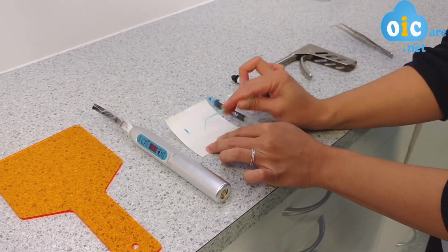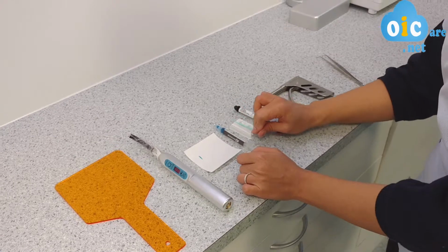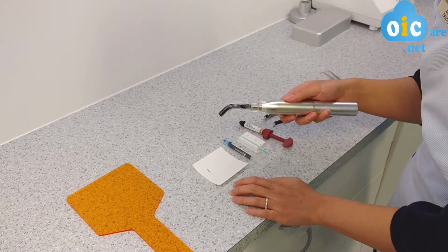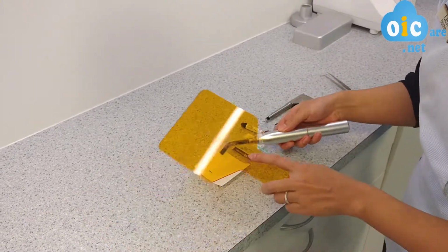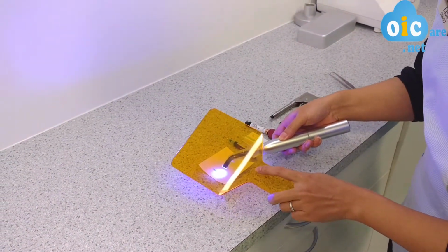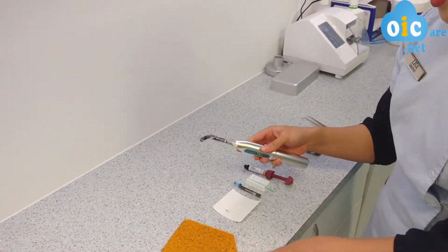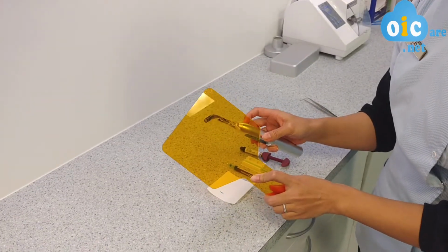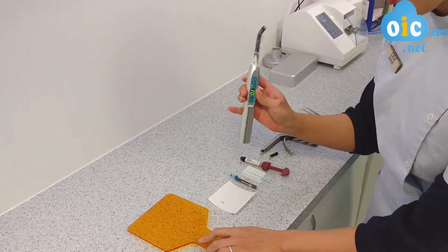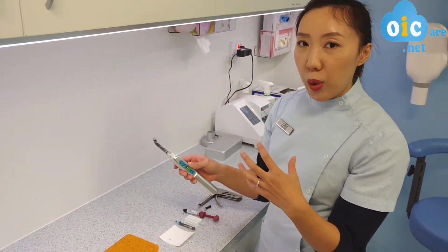We just brush it on with a little brush like this. This is called a micro brush. This acts as the glue, and then we will shine light onto the glue to make it really sticky, so that it's no longer liquid. We just shine light on where I painted the glue. A lot of people are wondering what this is. This is just a very strong LED light, and this is just to protect our eyes. There is no UV or any sort of radiation involved with this. It's just very strong light, because resin is light cured, so light makes it go hard.